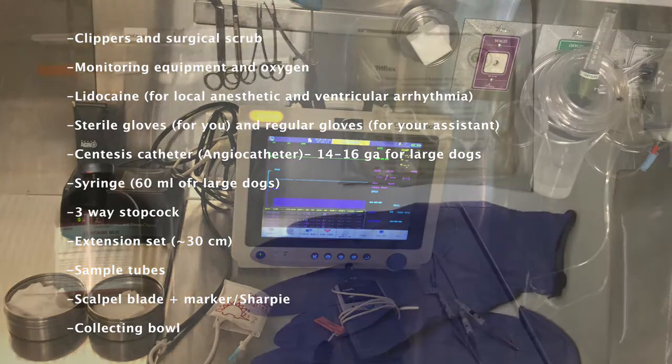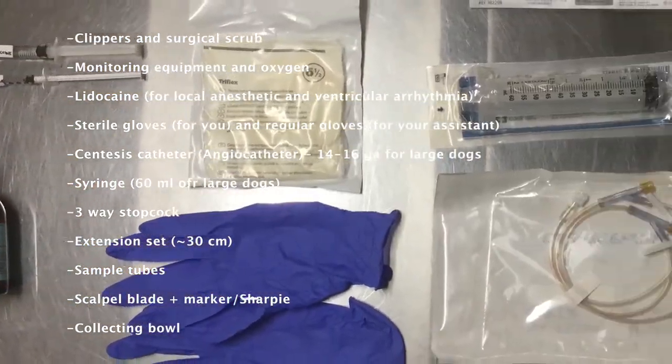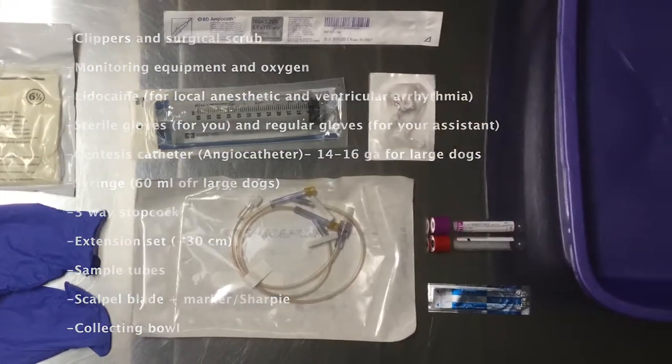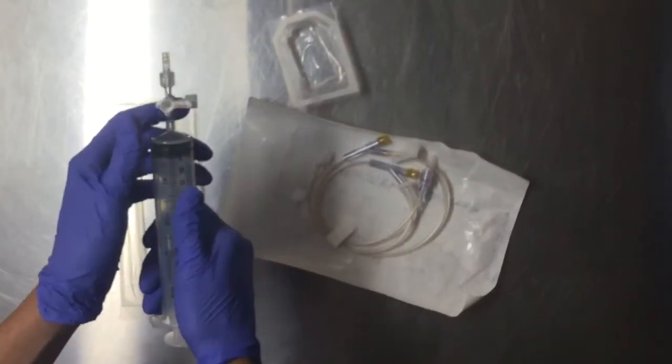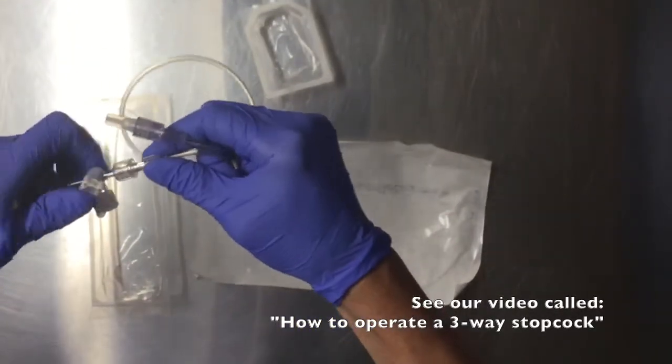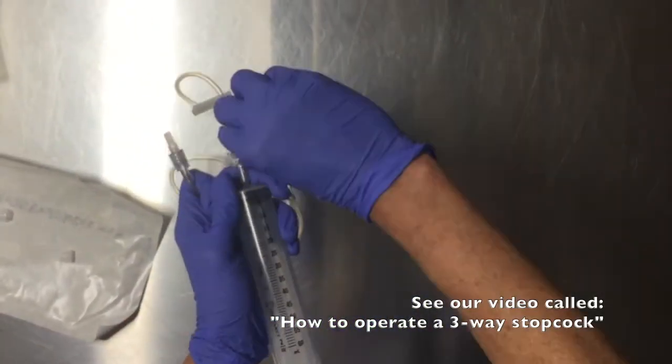Start by getting all of your supplies out and ready to go. Remember to label any syringes containing drugs or medications. Attach the extension set to the three-way stopcock and syringe, and ensure that all of the connections are very secure. Make sure that your assistant knows how to operate the three-way stopcock.